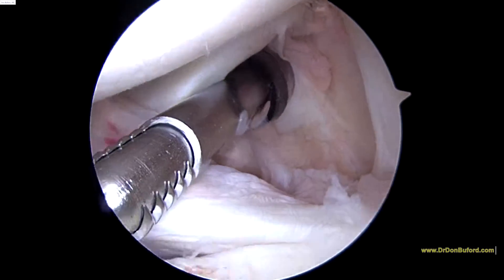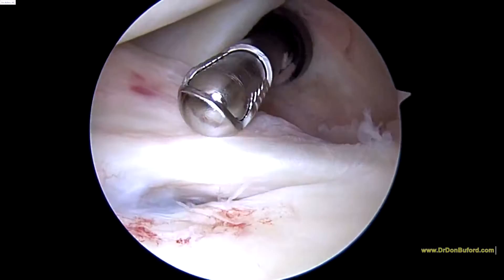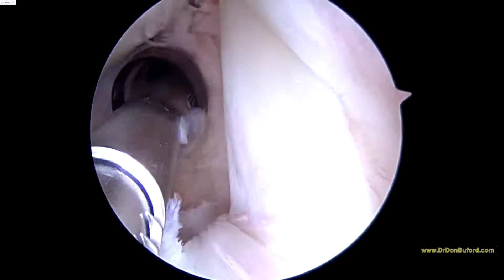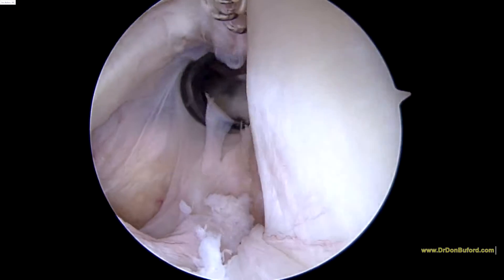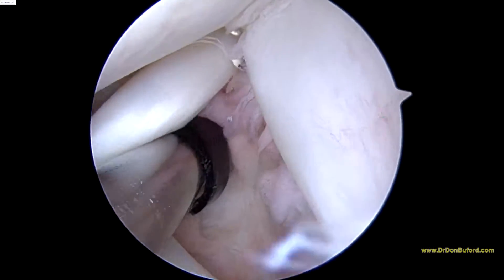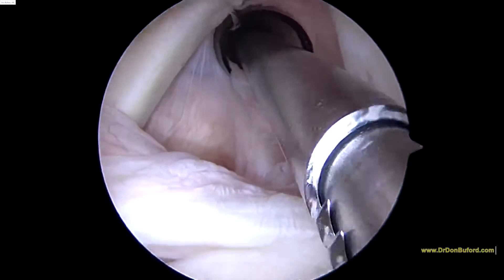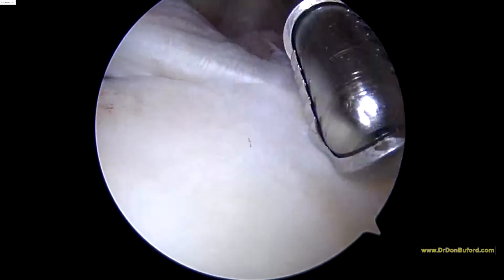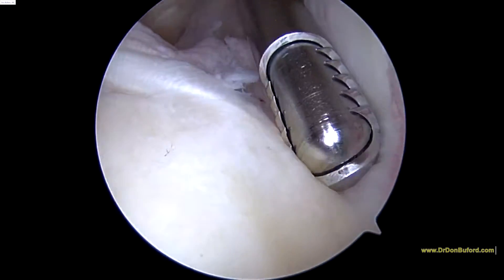Right now we've got an instrument called the shaver coming in. This just helps us because you can use it as a probe. You can also use it to debride any inflammatory tissue or any scar tissue that we see. The first thing we usually look for is the biceps tendon, which is a strong rope-like structure running up towards the top of the screen. It actually looks very good. We'll look down at the biceps anchor and that looks great.